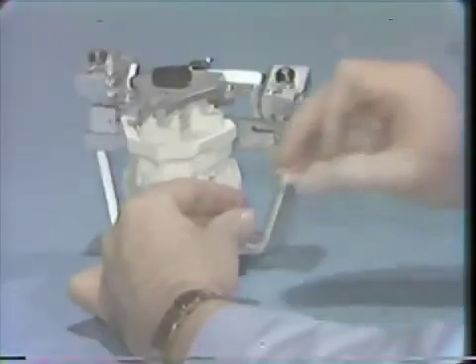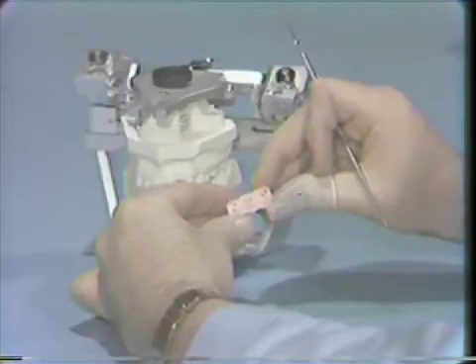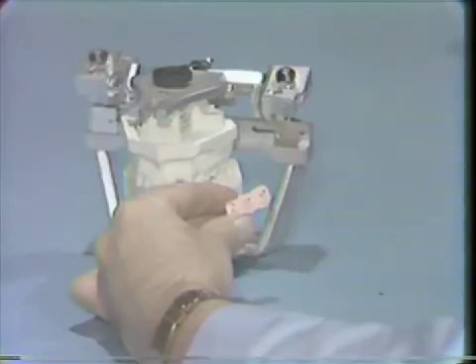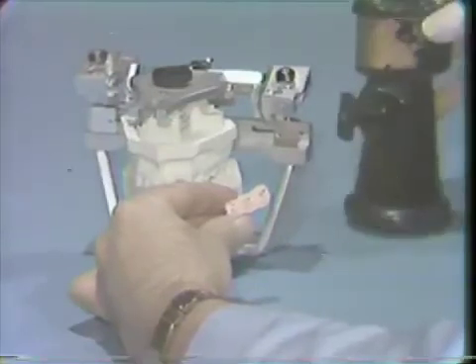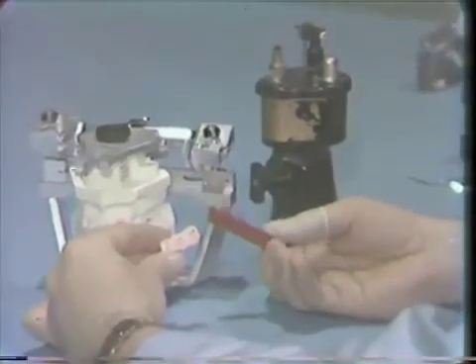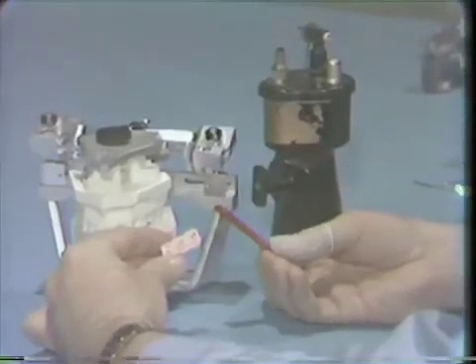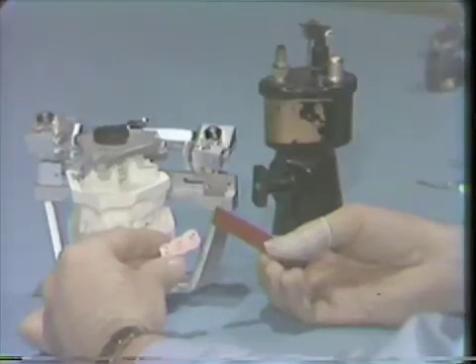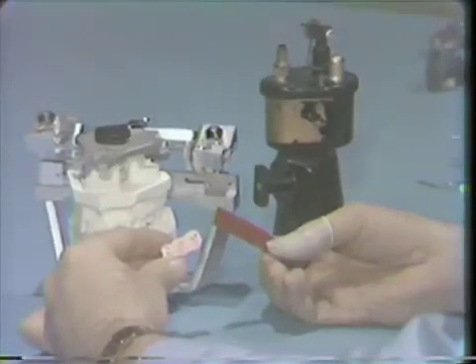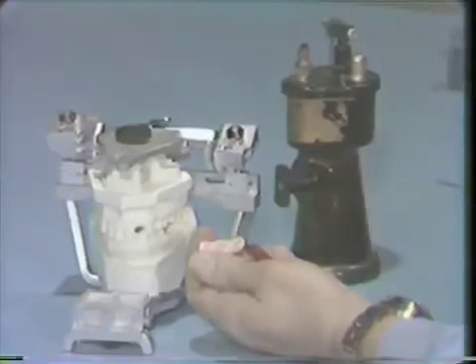After we have done this and trimmed down our platform, as we showed you previously, we can apply the wax into which we will generate our functionally generated registration. And in this particular case, we are going to use a material called Bosworth's synthetic tacky wax. It's a soft red material which is much like utility wax. There is another wax on the market which is made specifically for this purpose also, made by Jelenko Corporation, called Hi-Fi wax. So we'll now apply wax to our platform.